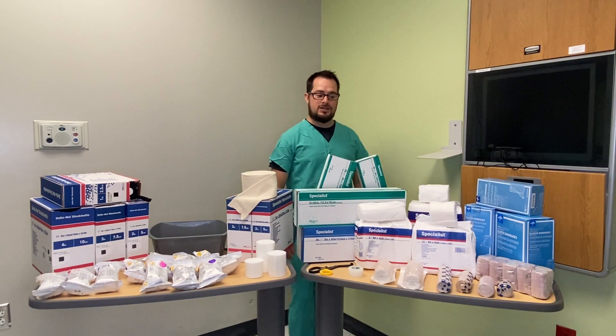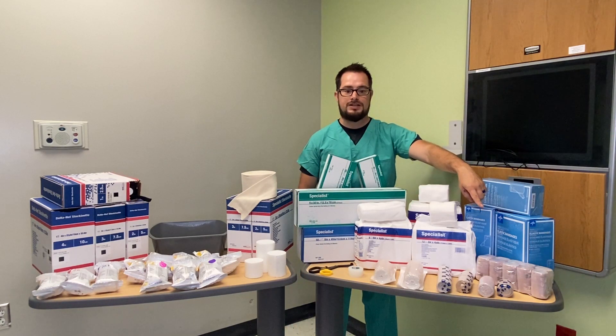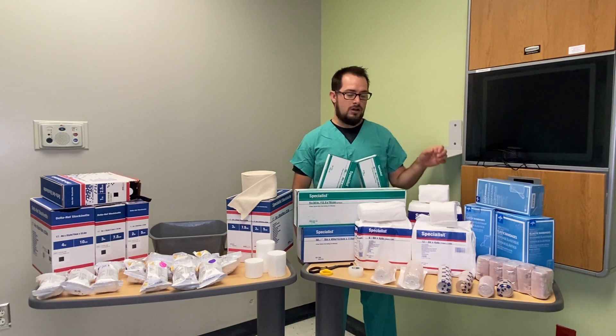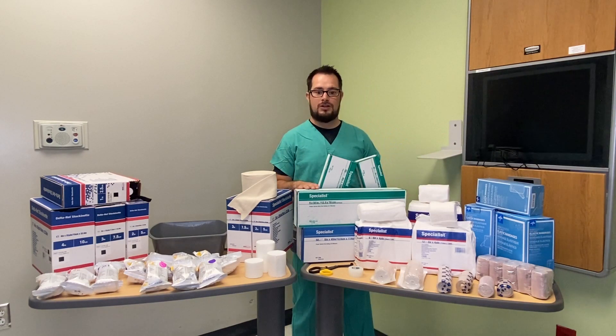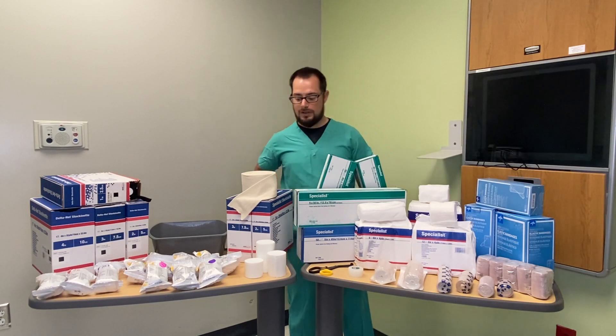For the plaster of Paris, the materials we use include two different style base wraps. We have two, three, four, and six inch style clips, and a four inch and six inch style velcro. For web roll, we have three, four, and six inch. We have plaster in two different styles: in the blue box is a fast setting which dries in five to eight minutes, five inch by 45 inch. In the green boxes we have three sizes: three inch by 15 inch, four inch by 15 inch, and five inch by 30. The draw time is two to four minutes. We also have tape, scissors, and stockinette.